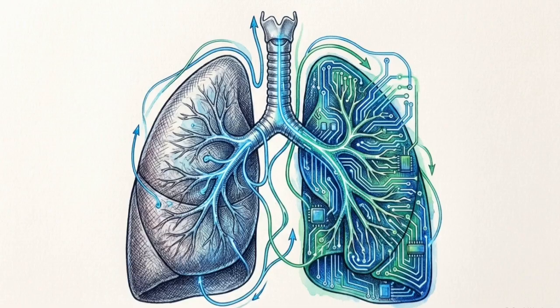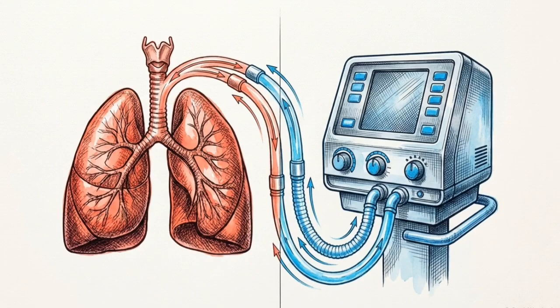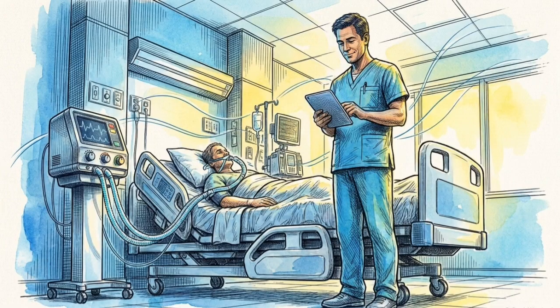A ventilator is a logic circuit that adheres strictly to the physical limits of the human airway and the specific inputs we program into it. By consistently identifying who starts the breath and exactly what is controlled, you predict the machine's behavior, anticipate the physical trade-offs in the lungs, and safely manage the patient's respiration.